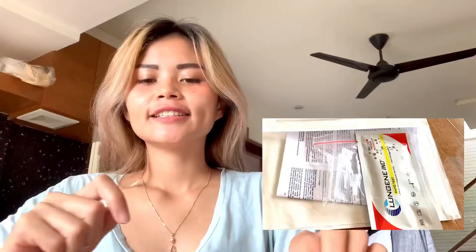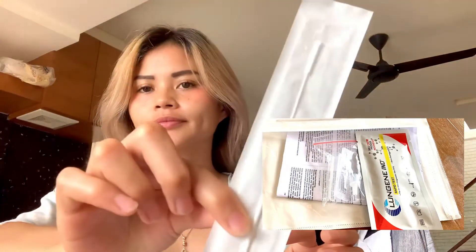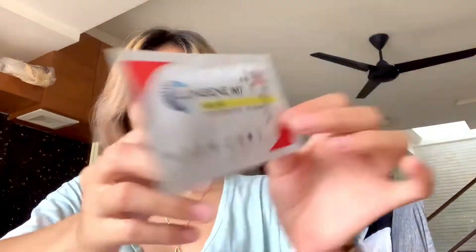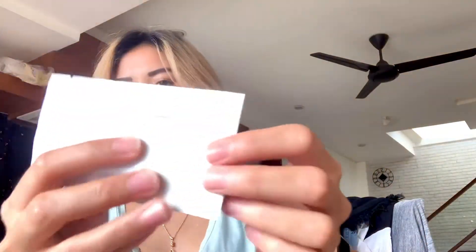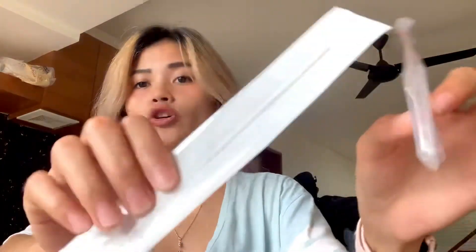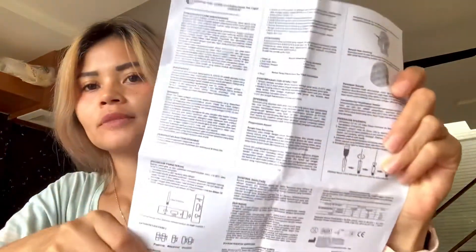Oke guys, jadi di dalam plastik ini tuh ada apa aja sih? Isinya itu ada ini — buat naruh di hidung. Terus ini ada Rapid Test, brandnya itu Klungin ya guys. Ini masa expirednya masih sampai 2023. Terus ini ada kayak cairan gitu, jadi nanti ini akan dimasukin di sini. Terus ini ada buku petunjuknya guys, ada keterangannya dan segala macam.